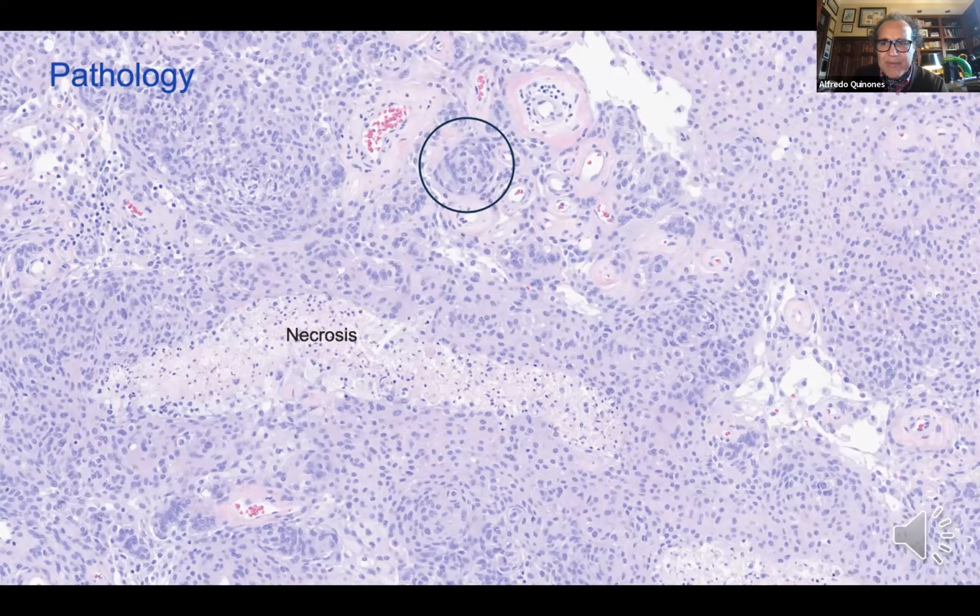So I just want to make sure that people understand those principles of debulking the tumor, devascularizing the tumor, debulking the tumor, and then the tumor becomes more manageable. He was able to move away, and he put zero retraction in the brain. By the way, zero mannitol as well, especially in these patients whose brain is already, when you finish, you'll see how much more relaxed they are. So beautiful dissection, JP. Great work.